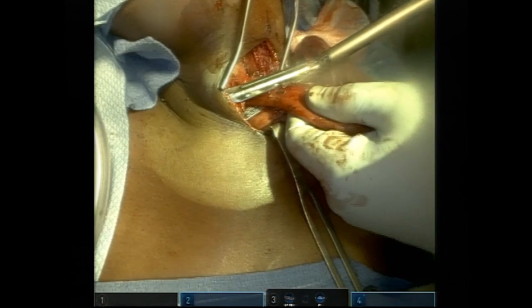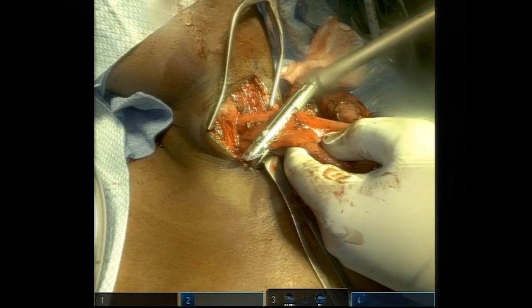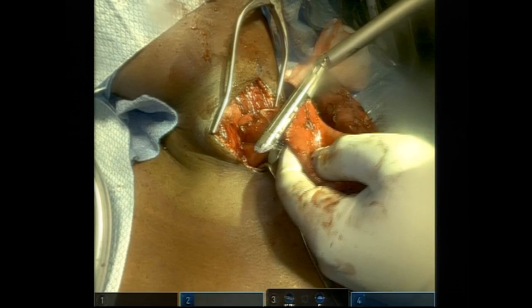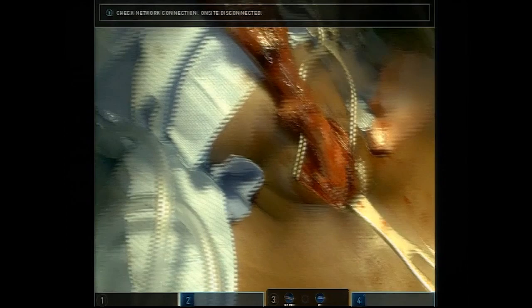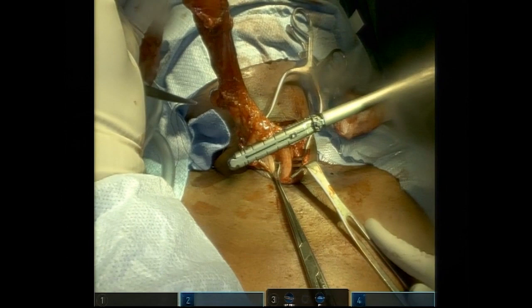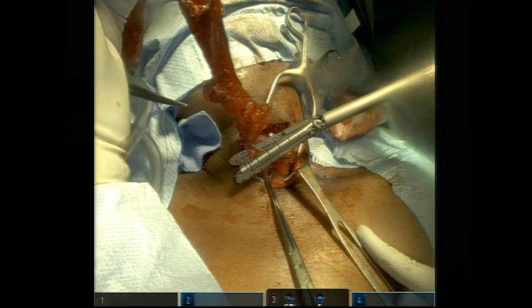Next, we divide the proximal cervical esophagus. You can appreciate the dilated esophagus. We then proceed to divide the distal esophagus distal to the GE junction. The resected specimen is shown.